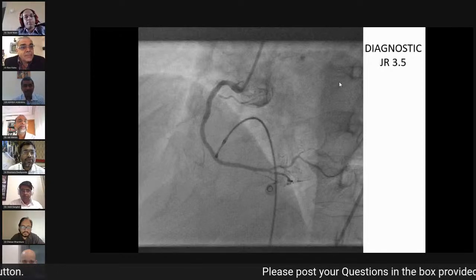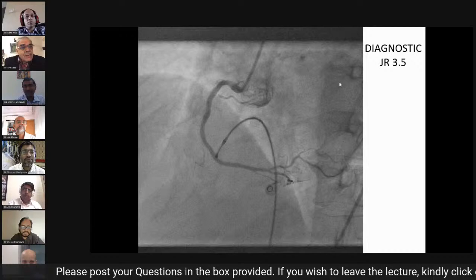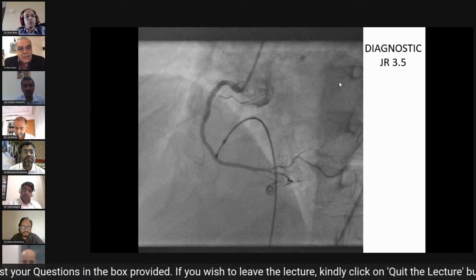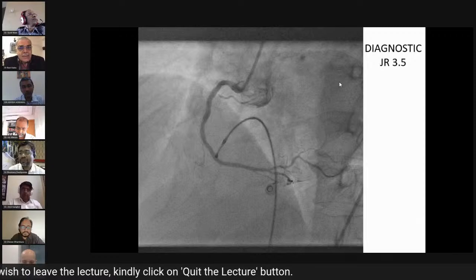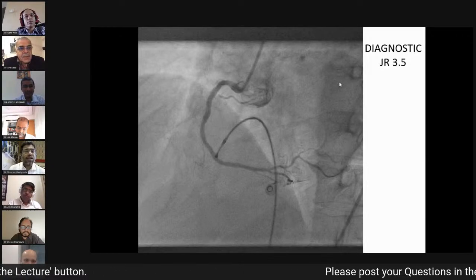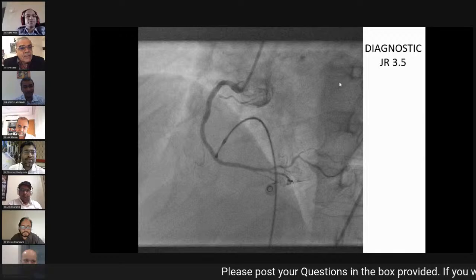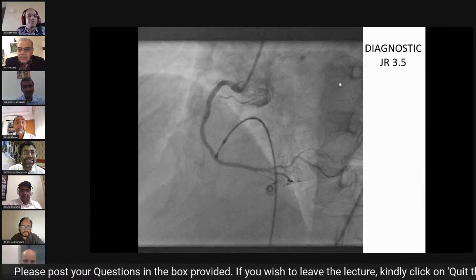One comment I want to add, sir. The OCT guy was also very sure that there is a big spur there, which is probably causing all the problems. So if a spur is there, this OPN balloon, rota or IVL, I don't know if we have anything related to capture an eccentric spur. Yeah, for an eccentric spur only orbital atherectomy works, which is not available.